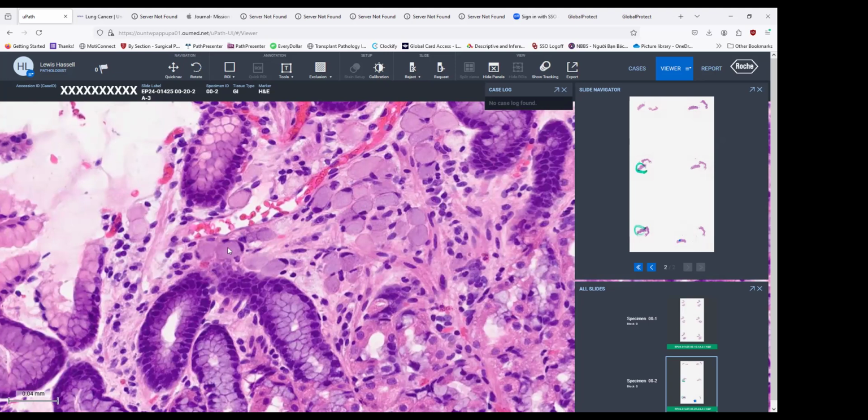You might look at, are these keratin positive? That would be confirmatory rather than being histiocytes, but they don't have the foamy cytoplasmic character that we might expect with histiocytes. So I think this patient has or had a gastric cancer.